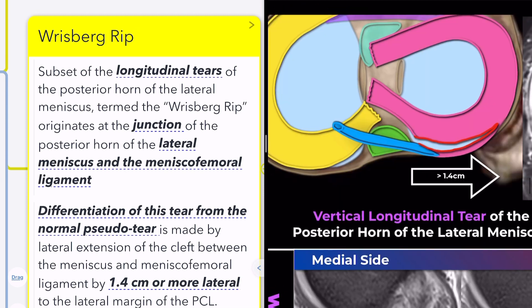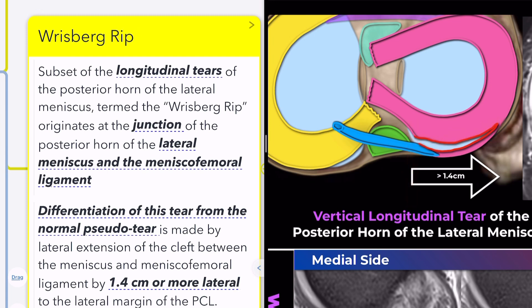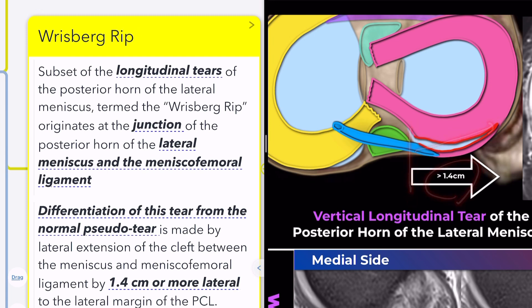On axial imaging, the lateral extension of the cleft signal between the meniscus and meniscofemoral ligament should measure 1.4 cm or more lateral to the lateral margin of the PCL.